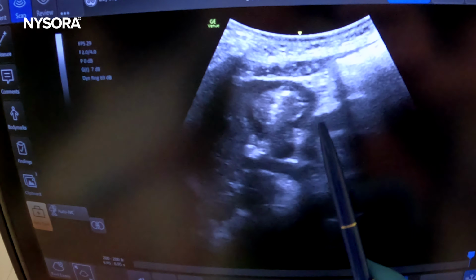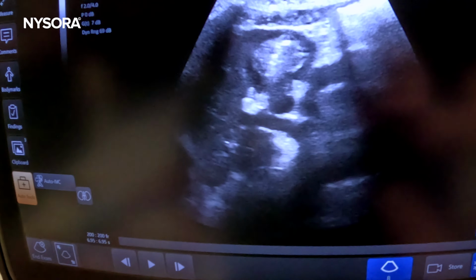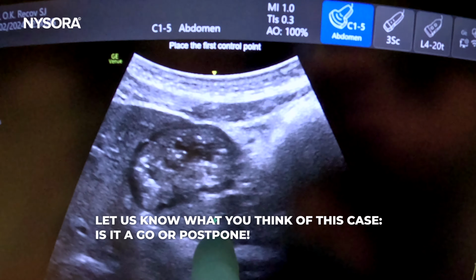And that was it, the practical application of gastric ultrasound. Gastric ultrasound can provide a more accurate assessment of gastric content and volume than the traditional fasting guidelines that are based on time intervals, because individual variations in gastric emptying mean that not all patients will have an empty stomach after the specified fasting period.